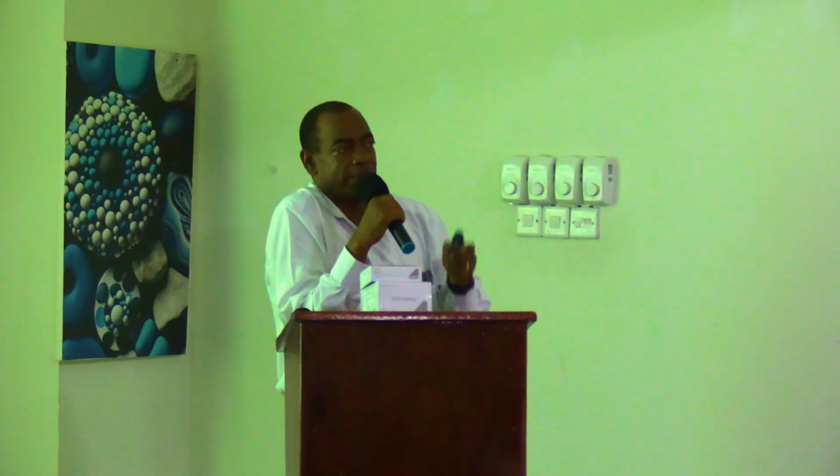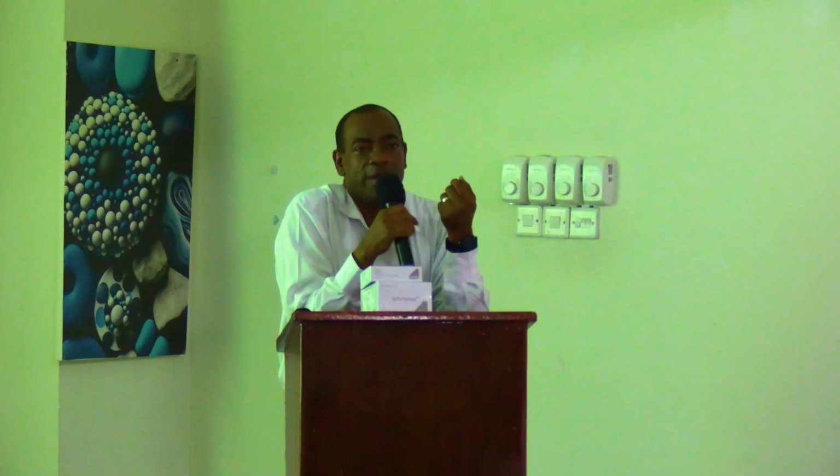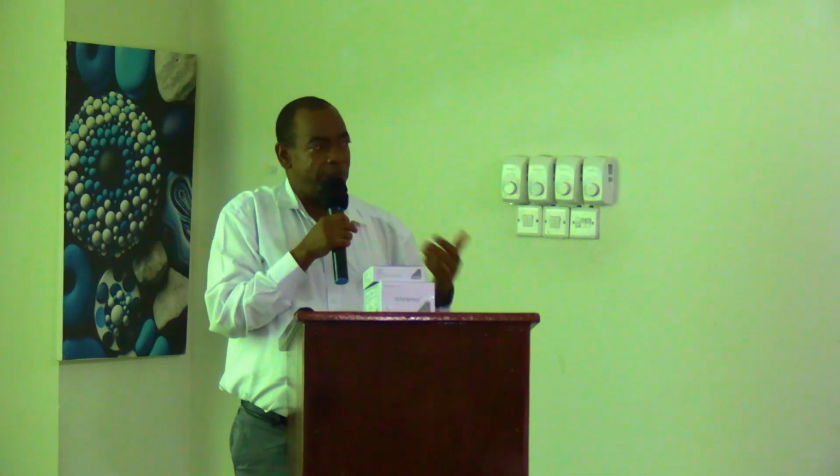The ID chip which we use has got 2 functions. One function is to inform the analyzer the test we are performing. So you insert it and the machine tells you the test. So that is the first function. The second function is to assist in the test. The calibration data, where is it? It's in the ID chip. So if we use an ID chip of a different lot, it means we are subjecting our test to a different calibration curve, and the results might not be as accurate as they are supposed to be.